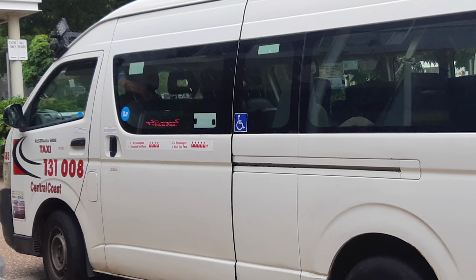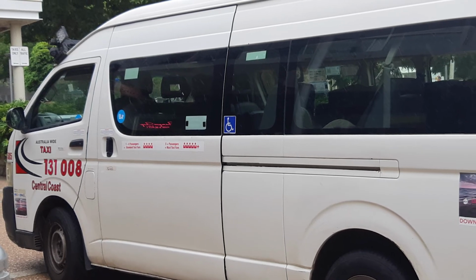When planning to attend venues such as cafes and restaurants, check with the staff when booking that there is mobility scooter access available. If you're planning to use a mobility scooter on public transport or in a taxi, make sure you choose a model that allows for this, as not all can do so. A wheelchair accessible taxi will be required.